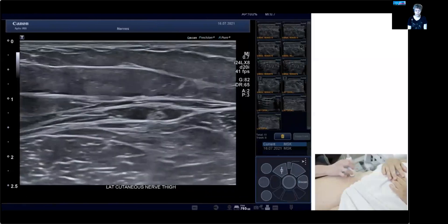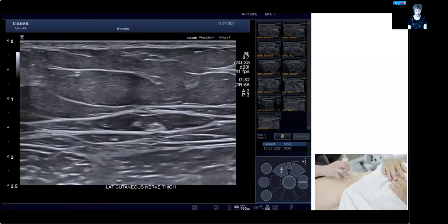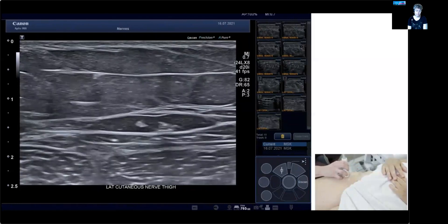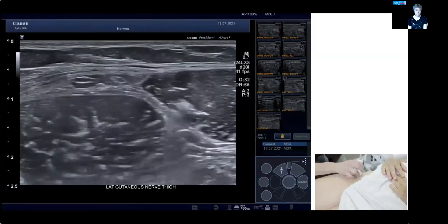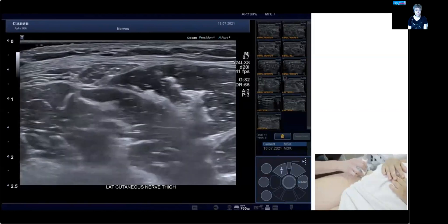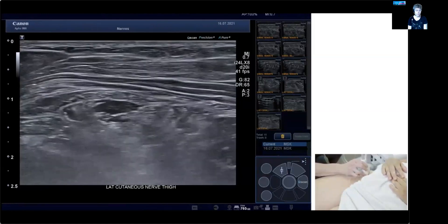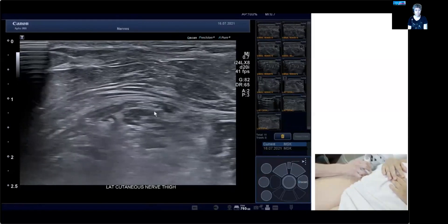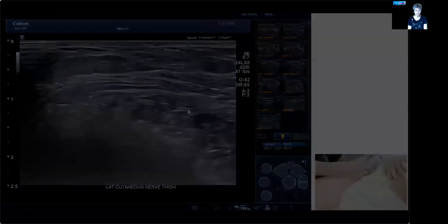We can follow the nerve a little more distally and it's going to split — this nerve branches a lot, so there are many branches. This is the first split, and now you have to choose whichever branch you want to follow. Going back up towards the anterior superior iliac spine, that is a difficult region because the nerve will dive deep with a very sharp bend at that spine level. It takes a little tilting to highlight it — you need an ultrasound setting with good anisotropy sensitivity. If you move the probe a little bit, you can see whatever part of the image the nerve is moving with you. If we go a little more proximal, you will lose it as it takes a sharp bend and goes deeper.